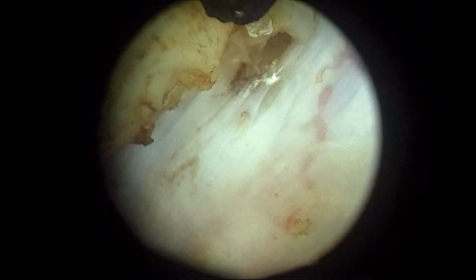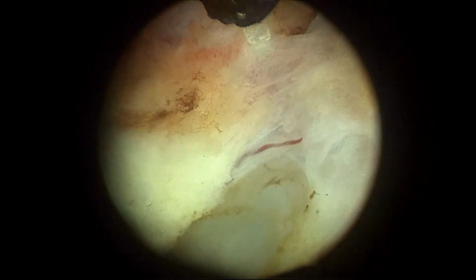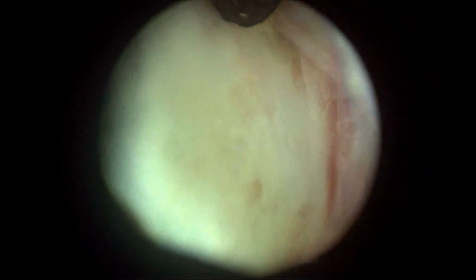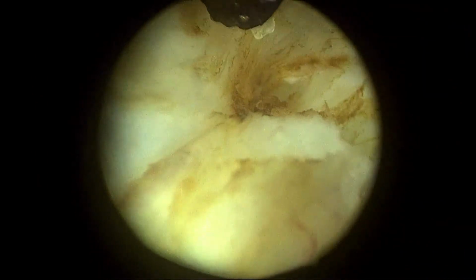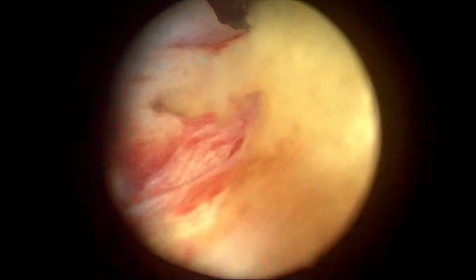One can see the vessels. Yes, sir, we can. And you can easily coagulate it. See, this is a vessel and you can just coagulate it. Not able to find that holy grail, come on. So I'm still not able to find that holy grail.